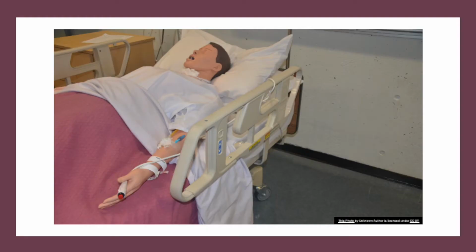So first things first, turn on the ECG machine and make sure it is working and calibrated correctly. The ECG paper speed should be 25 mm per second, and 1 mV of electrical activity should equal 1 centimetre on the grid paper. Explain the procedure to the patient and get their consent.